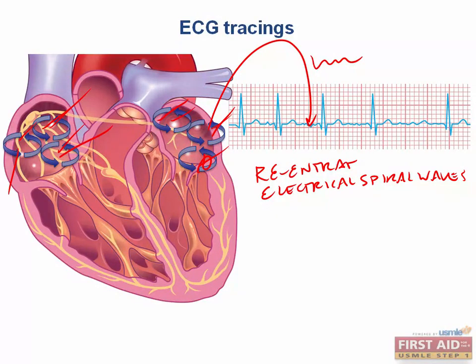If there is no unified large electrical vector depolarization, then all we have left on our ECG are the multiple individual depolarizations that are occurring in many different directions at many different moments in time. I repeat, these atrial fibrillations are just ununified depolarizations that are not synchronized chronologically. This is represented on the ECG by a chaotic and erratic baseline, which is classically defined as irregularly irregular, with no discrete P waves in between irregularly spaced QRS complexes.